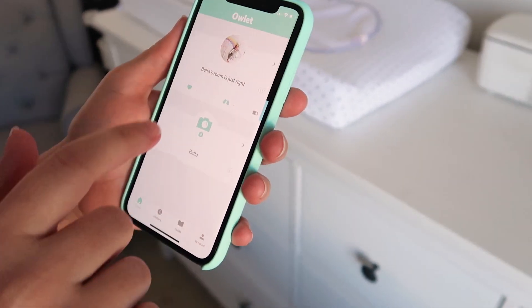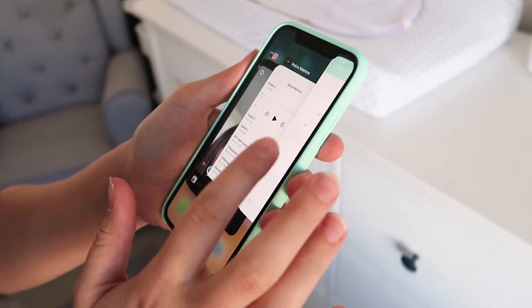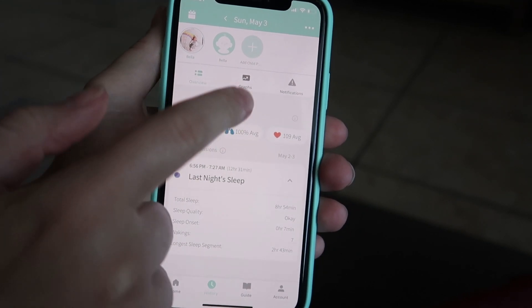The next pro is the app. When you get the smart sock or camera you download their free app, which acts as the monitor. If you want to check on baby and watch them through the camera, you go onto the app. I also enjoy that multiple people can download the app, log into the account, and have access — so my husband and I can both check in on her if we are away.